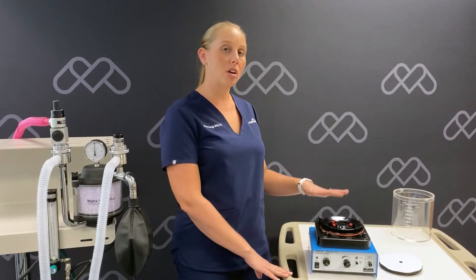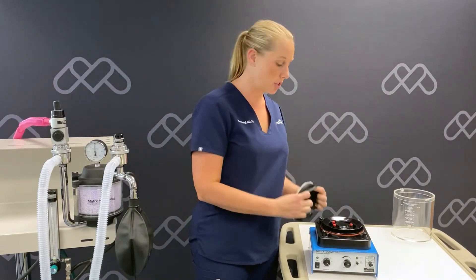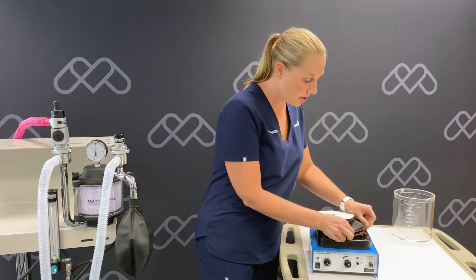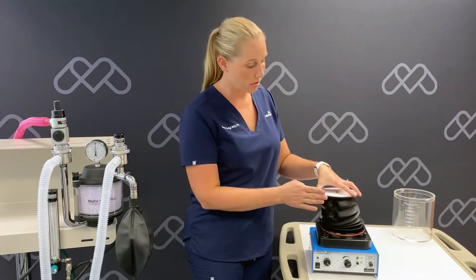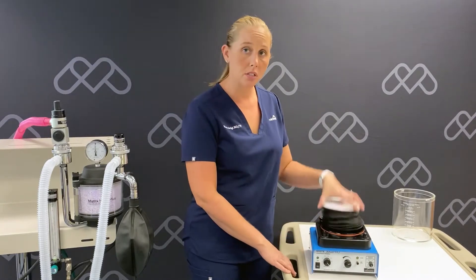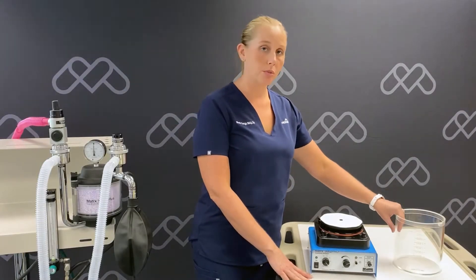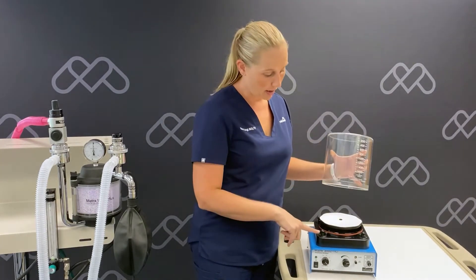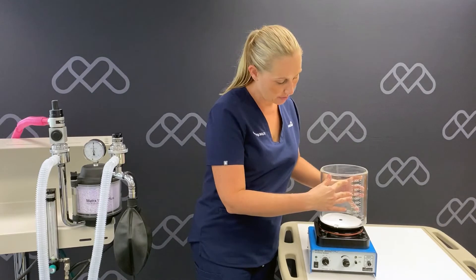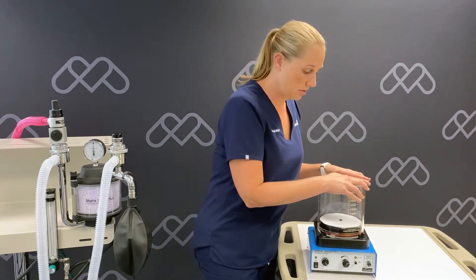Now we'll begin the install of our ventilator's components starting with the bellows. We're going to put the first convolution of the bellows onto the mounting ring of our bellows base. You can then grab the bellows top and lift and lower it several times so you get all the creases and folds out. Next, we're going to place our bellows housing onto the ventilator. You'll want to place the tabs to the right of the locks and have your numbers towards the front of your ventilator. You'll gently push down and twist.